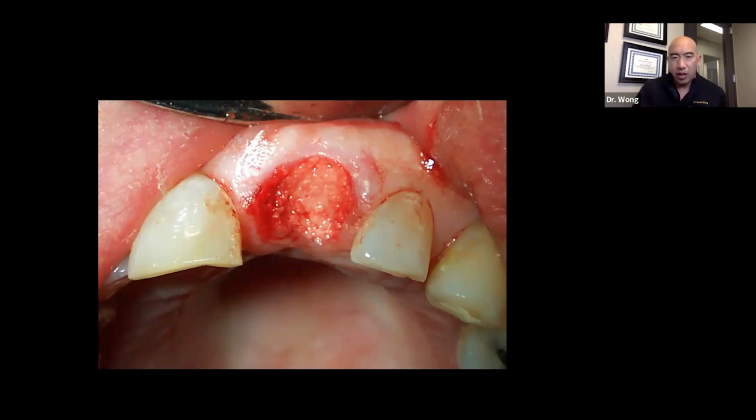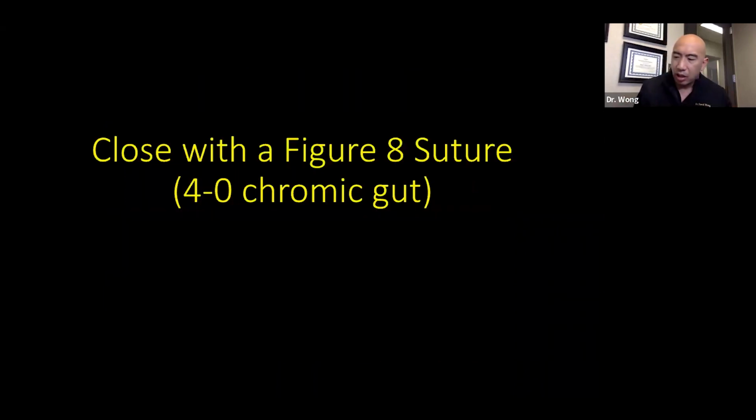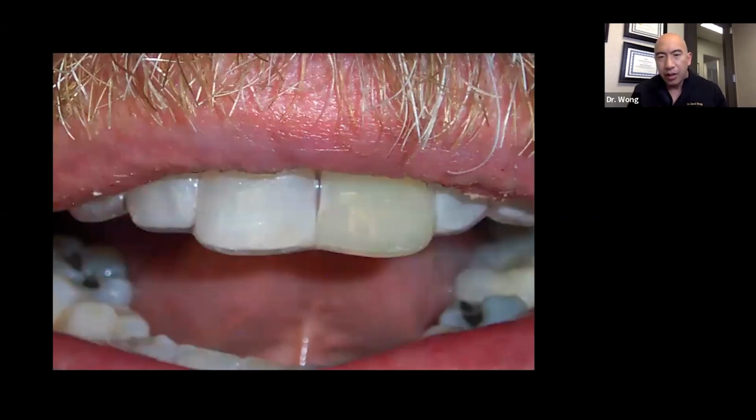And then all you're going to do is put your bone graft material into the socket and condense it with your cotton tip applicator. I use it dry whenever we have a bleeding socket or a patient with a lot of saliva, just because you're trying to condense this powder while blood and saliva is trying to get it to come out. So this cotton tip applicator is a real cheap and easy way of absorbing that moisture while you're condensing the graft.